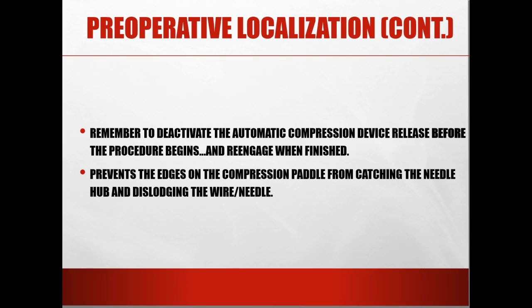So again, I want to remind you, remember to deactivate your automatic compression control at the workstation before the procedure begins, because you don't want to make an exposure, and you will be making exposures when the radiologist gets the needle where he or she wants it to confirm. If you make that exposure, that thing is going to auto-release and pull that needle out. And you're going to be starting all over again, because the patient then is going to pull away, move. It's really important to deactivate that. So remember to do that.